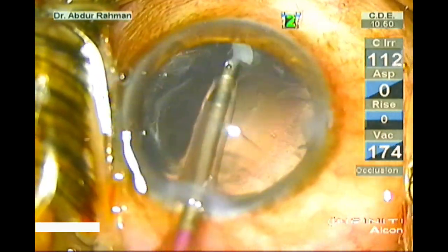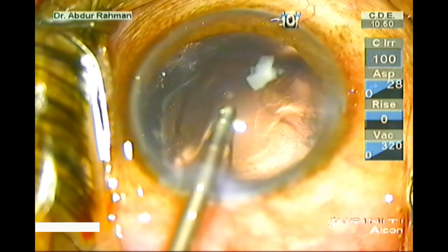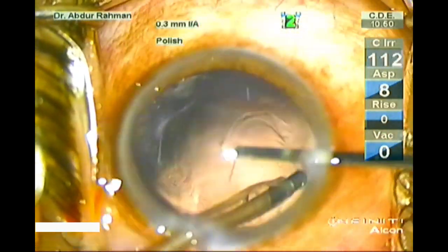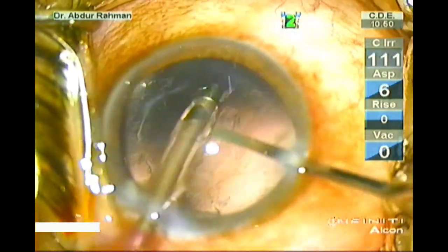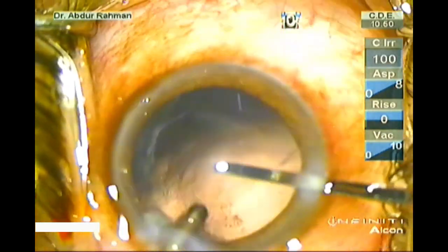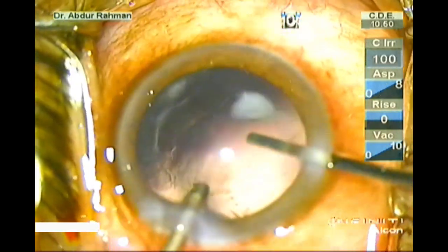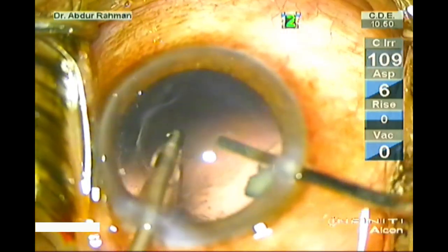Now start coaxial cortical removal. If any piece was left behind after closing the eye, it would not be absorbed and would cause significant inflammation. This piece is also hard and will not aspirate through the coaxial handpiece. I am busy removing all the cortex. In white cataracts, some cortex can become adherent to the posterior capsule and there are areas of fibrosis.